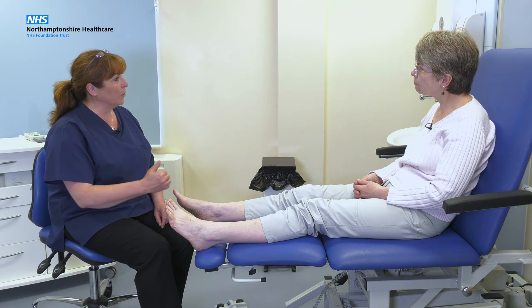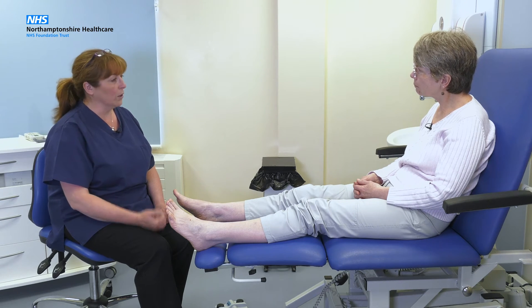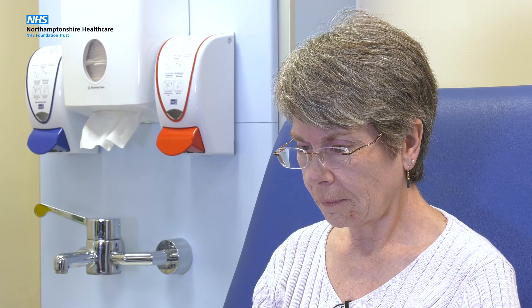So that's your foot screen completed today, Alyssa. We've looked at your blood flow into your foot and found that that's really quite healthy. We've also checked the sensation of your feet and found that at this time there's no deterioration at all — you were able to feel the monofilament in all the areas of the foot that we test for. Your pulses were fine and healthy on both feet, so we have no issues with the blood flow to your foot. That means that your foot's at low risk.